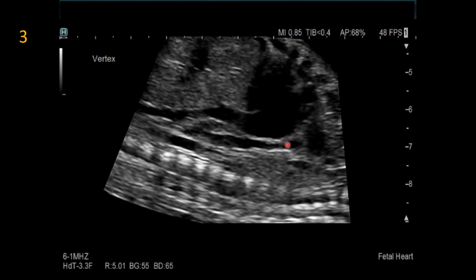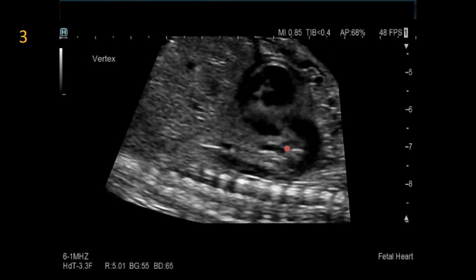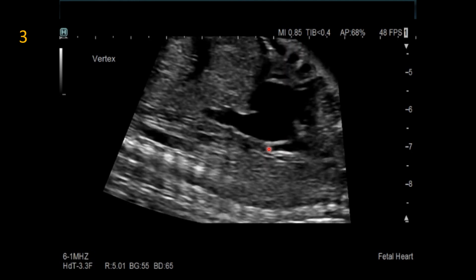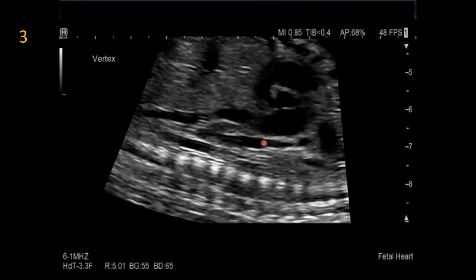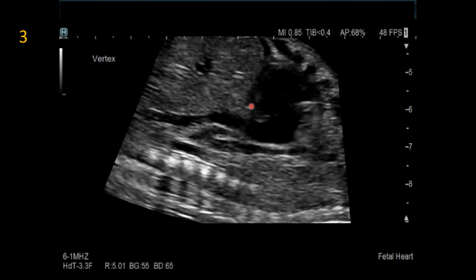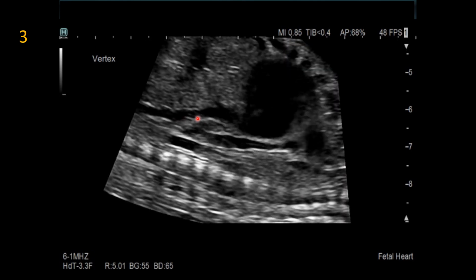Changed the angle here, again that same structure. Here is where the pulmonary veins connect to this vertical venous structure here that goes below the diaphragm. This is the level of the diaphragm, here's the IVC, again continuous IVC.